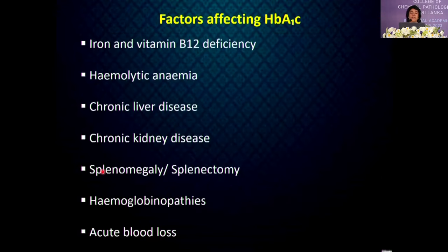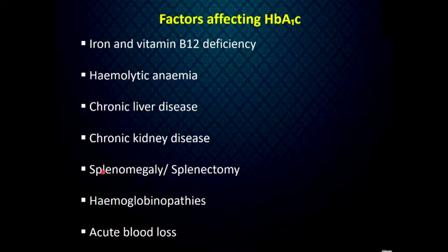Various factors affect HbA1c results because the test depends on the normal lifespan of red cells. In iron deficiency anaemia, results are falsely high due to a larger proportion of old red cells. In haemolytic anaemia, red cell lifespan is reduced and results are falsely low due to a higher proportion of new red cells. In acute blood loss, values are also low for the same reason.